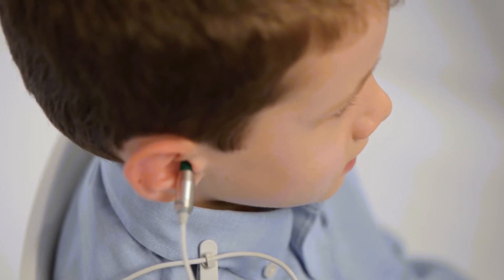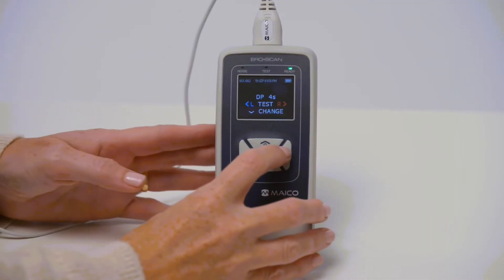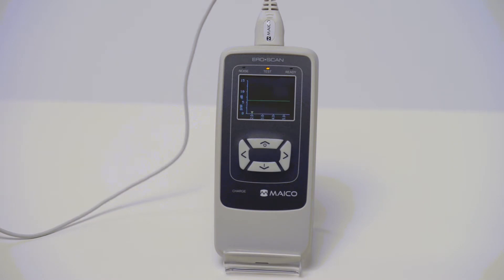The probe should remain in the ear without being held during the test. Select the ear by pressing the left arrow for the left ear and the right arrow for the right ear. The probe check will start automatically followed by the OAE test. In the event the test does not progress, try repositioning the probe or changing ear tip size.